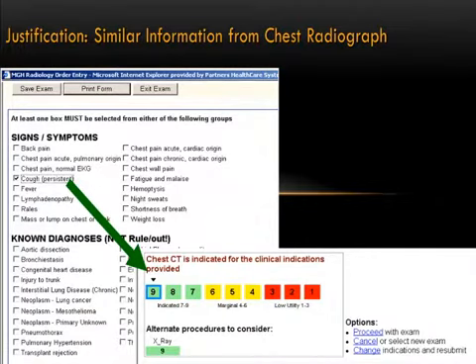So if the patient has had a chest X-ray before, obviously the physician will choose to go with chest CT because the X-ray didn't add the information that the physician wanted. If not, he will get a chest X-ray. Now, the insurers, when they do the reimbursement of these exams, actually track the appropriateness score in our hospital, so physicians who are consistently ordering exams with low utility scores have lower reimbursement rates. So that's how they are forced to adapt and use the system.